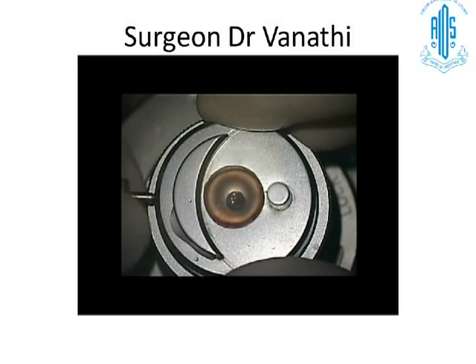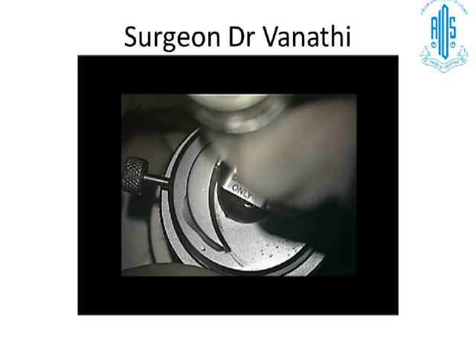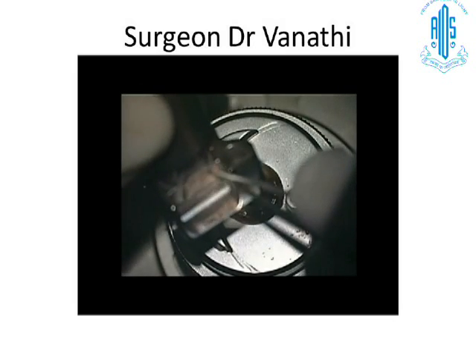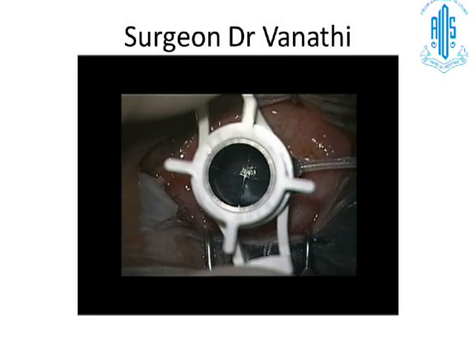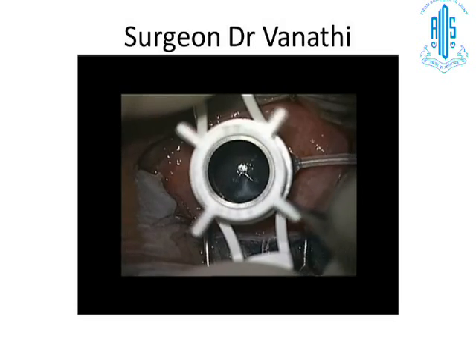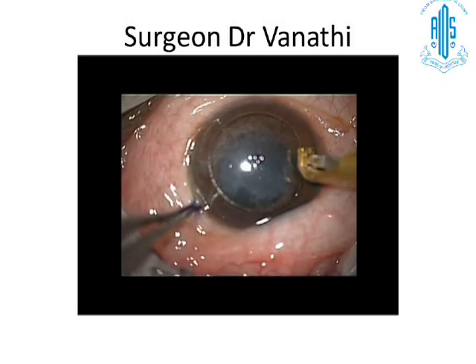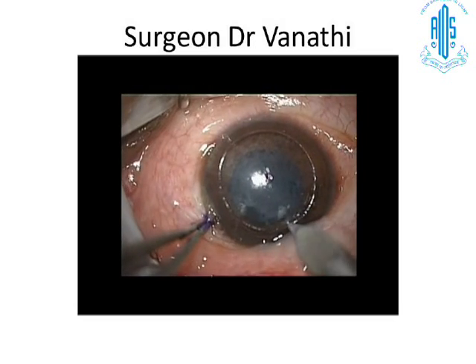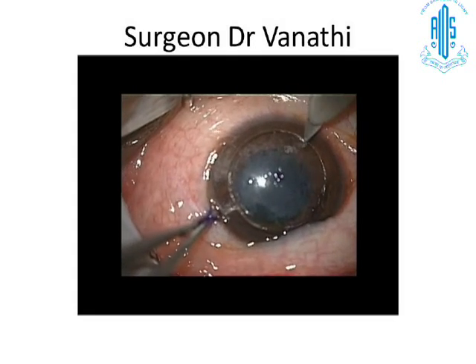Here is the microkeratome cutting of the tissue, where a 200 micron head was used, and the donor tissue was cut, the lenticule was confirmed, and then the host button was trephined. A partial thickness depth was dissected with the help of the Hessburg-Barron trephine, and we also reconfirmed this by using a micrometer diamond blade to reconfirm the depth and dissect just up to that level.